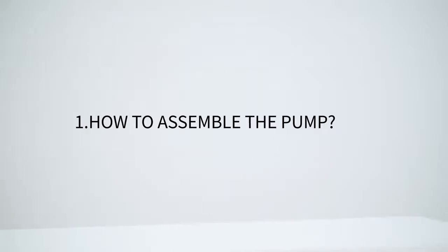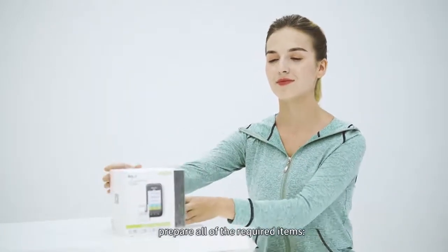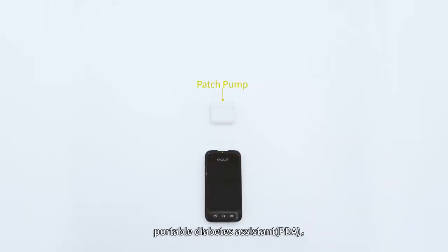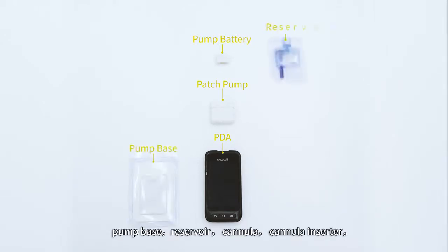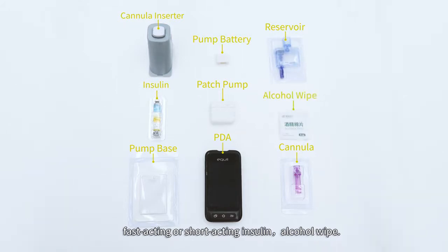1. How to assemble the pump? First, prepare all of the required items: the patch pump, portable diabetes assistant PDA, a fully charged pump battery, pump base, reservoir, cannula, cannula inserter, fast-acting or short-acting insulin, alcohol wipe.